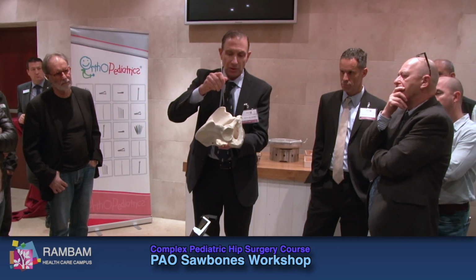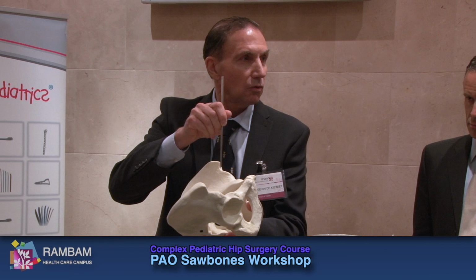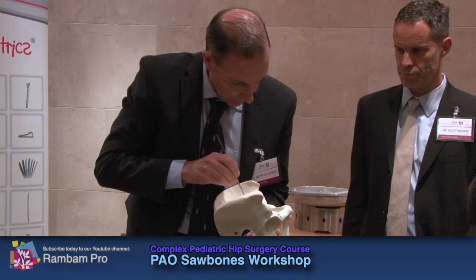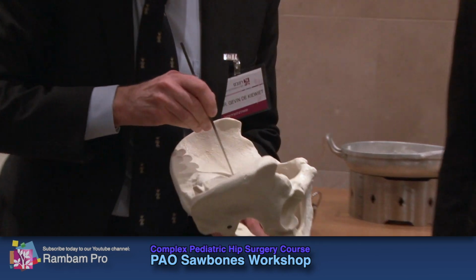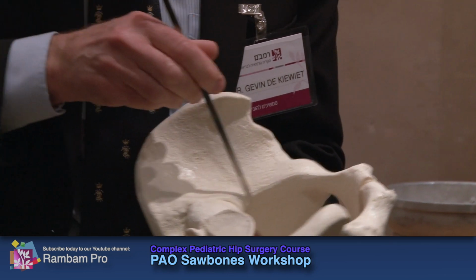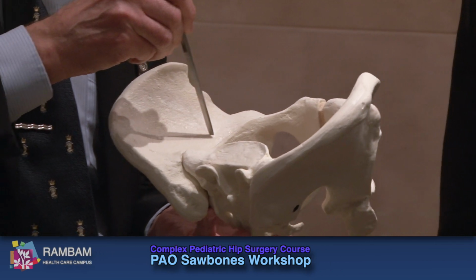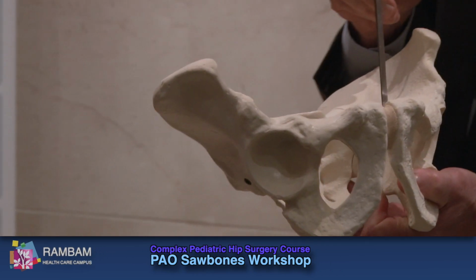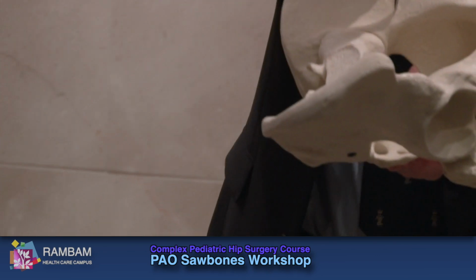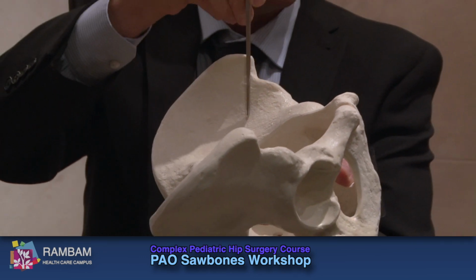So you do your iliac osteotomy, which starts, your cut of the anterior iliac spine is here, just at the edge of that cut will be where you want to start this. And at this point, on the inner table here, about 1 centimeter above the brim, right? You have a brim, your retractor will go in here and do that. At the brim there, 1 centimeter away, you'll put a mark. And you saw in the picture, it'll blur, it's quite easy to do a mark there, something to aim at. Okay? There. And then your osteotome will go perpendicular to the ground. From here, straight down. Okay?